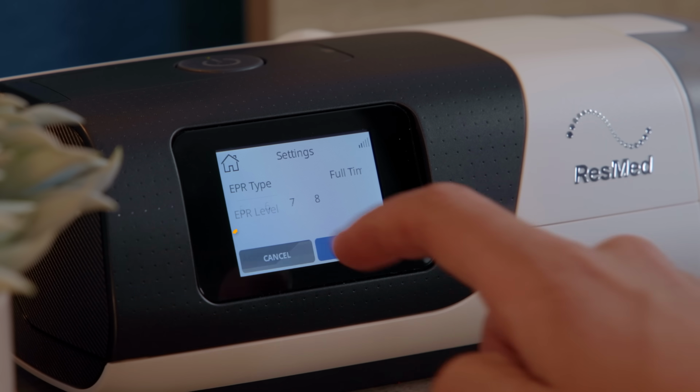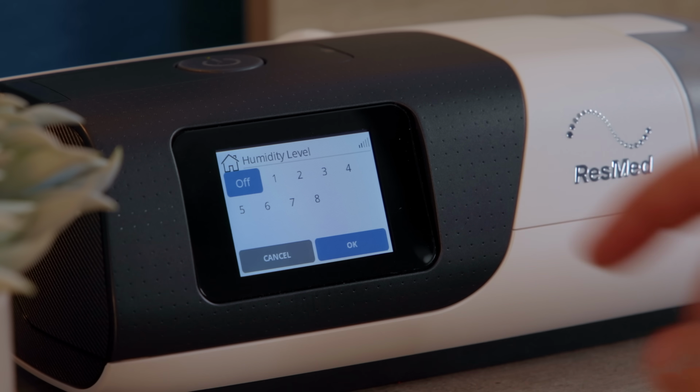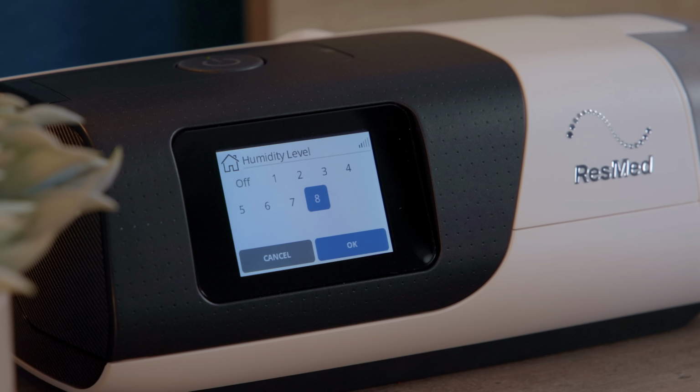This setting changes the moisture levels entering the air from the humidifier. The idea here is to put enough moisture into the air to avoid your airway from getting dried out, which is uncomfortable, but not too much humidity that you get water sloshing around in the tube, which is known as rainout, which causes gurgling noises, water droplets to spray on your face, and just generally it disrupts your sleep.